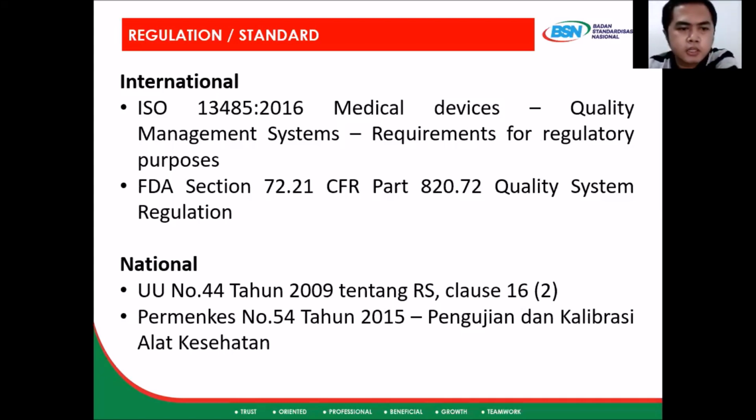And then nationally, there's the regulation from the government, which states in Law number 44 year 2009 about hospitals, in clause 16.2, that every medical device should be calibrated. And there's also the national regulation, the Ministry of Health Regulation number 54, year 2015. This is about the testing and calibration of medical devices.